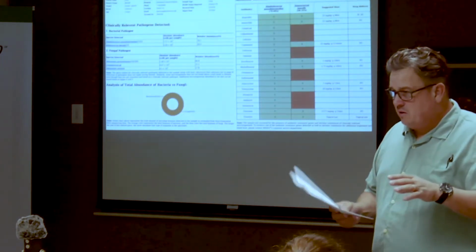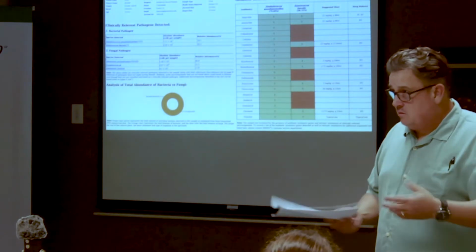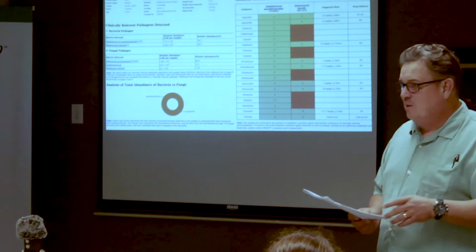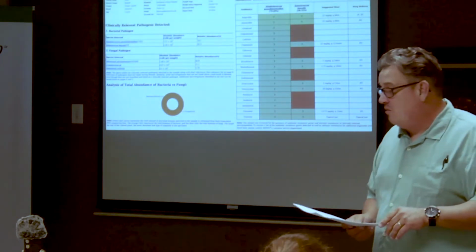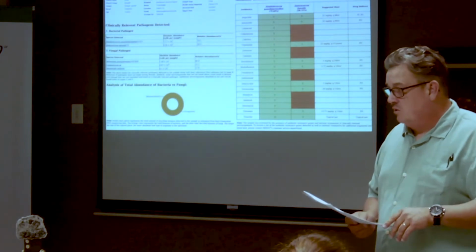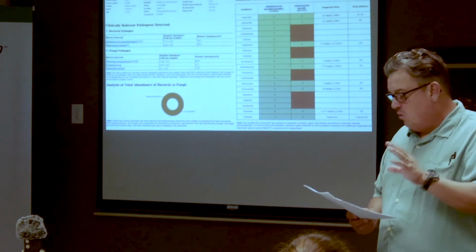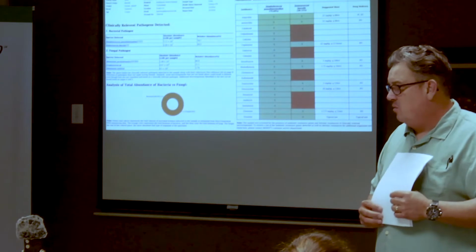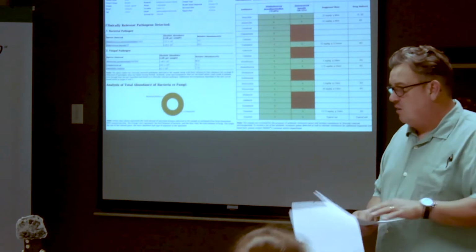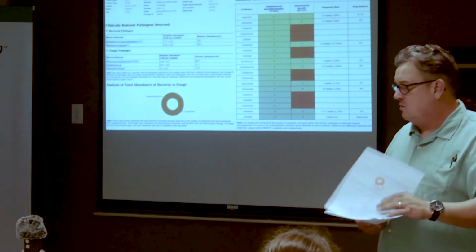I'm still culturing because, I don't know, I guess I'm still comparing the two in a lot of ways. Don't tell them I said that. But I'm really leaning more towards the sequencing now than the culturing because I'm getting more information and I'm able to treat a little bit better. I've had a lot of success treating off the genetic resistance rather than just the sensitivity resistance.